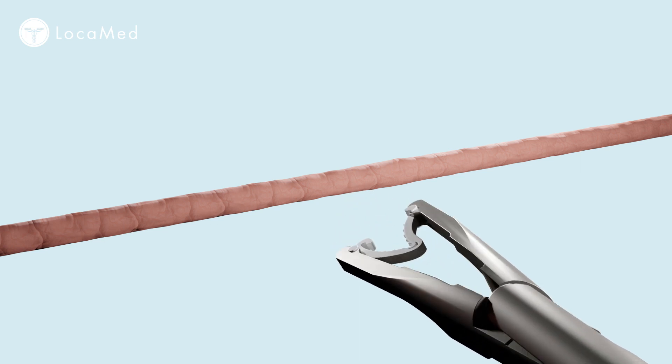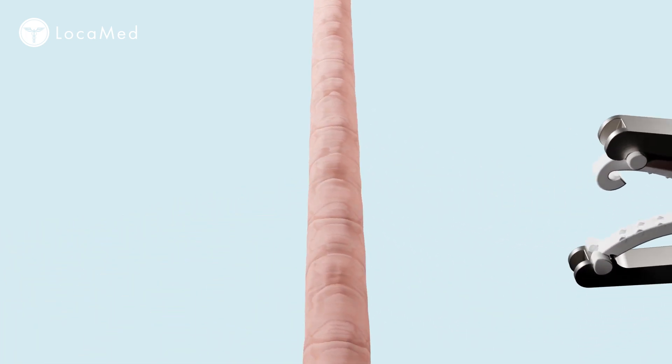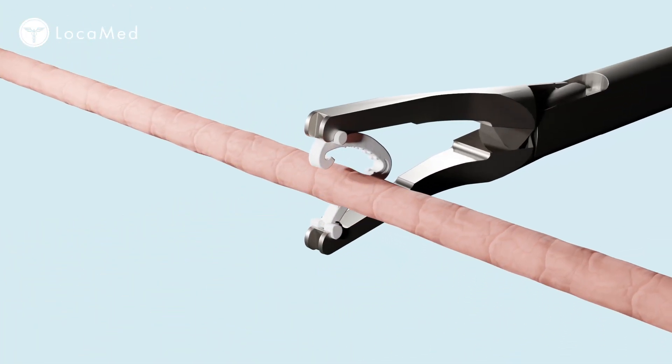The applier jaws can be rotated for maximum visualisation, but the rotation knob should only be used with the jaws in the open position. Place the clip over the target vessel, ensuring that you have full visualisation of the tip of the jaws.